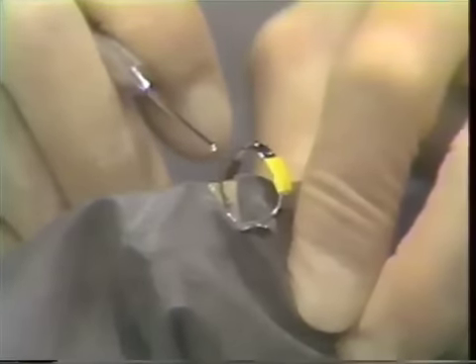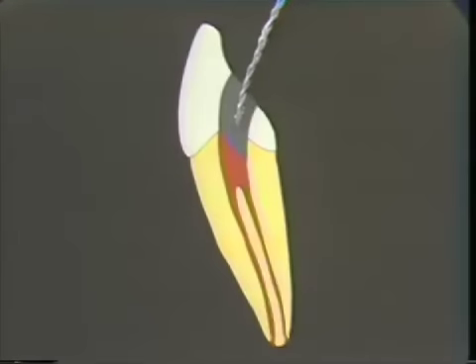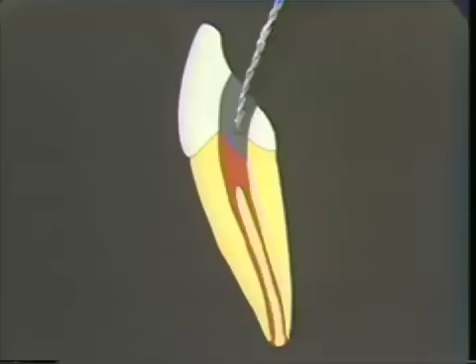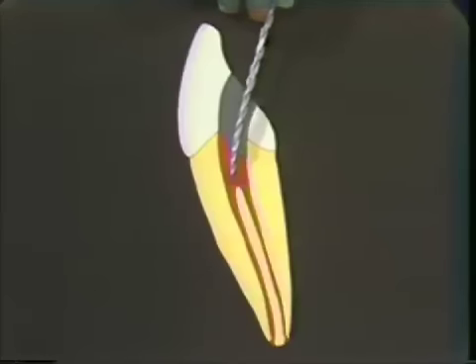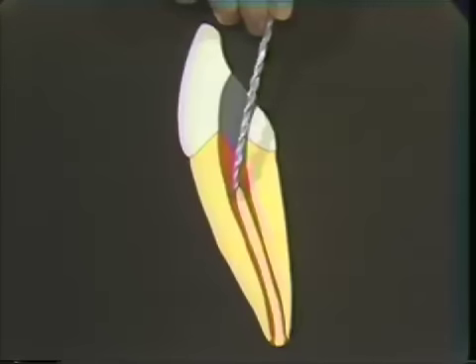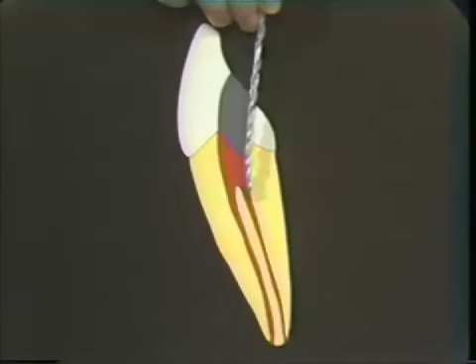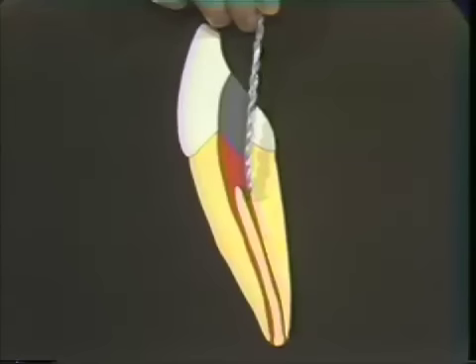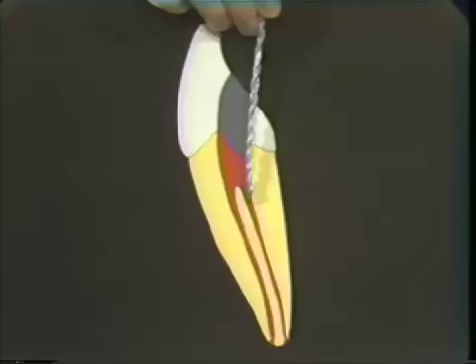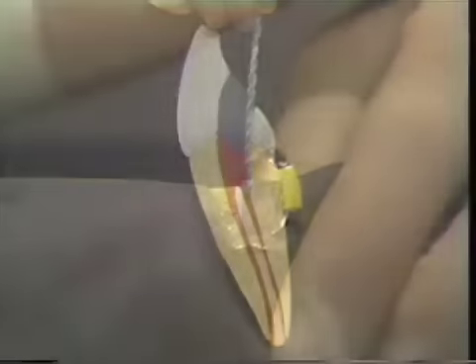As you can see in the cross-section diagram, you can come in through the access preparation from the lingual heading towards the buccal, go all the way down, and the wall will guide you into a canal. If you have a second canal, when you lift the file up and go in the other direction, you'll be able to feel a little click, and the file will be going in a different direction as you slide over into the second canal. So always check mandibular anterior and bicuspid teeth for two canals.